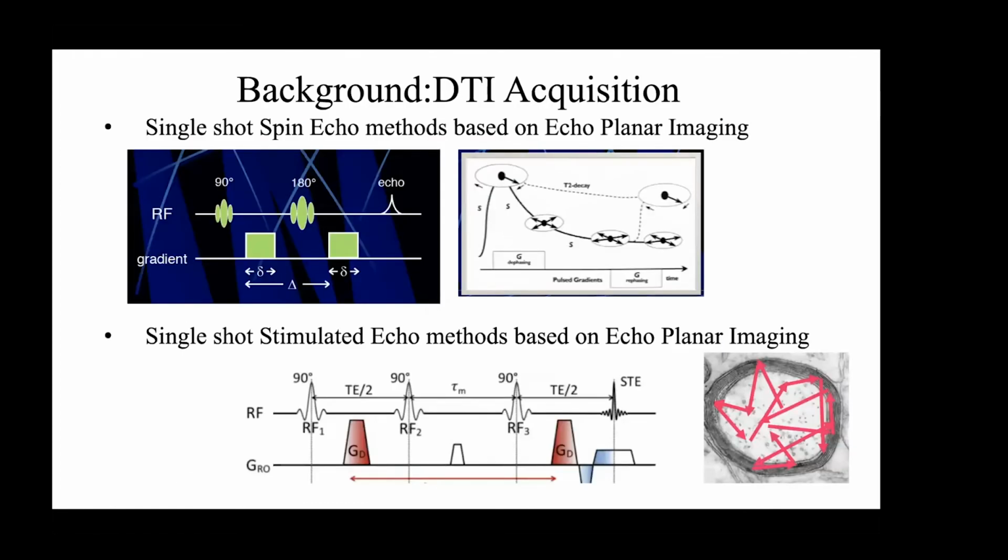Very briefly, I'll be showing results from 2 different types of techniques used in MRI to measure these diffusion mobility coefficients and anisotropy. The first one is available on all the scanners. It's called spin echo diffusion imaging, and it's a very fast technique, because if you're sensitizing the image to very small motions, you have to make it fast enough so that it's not sensitive to larger or gross motions or physiological motions.